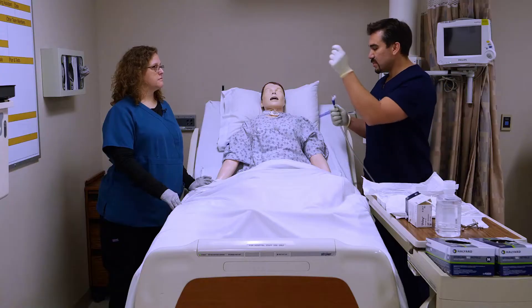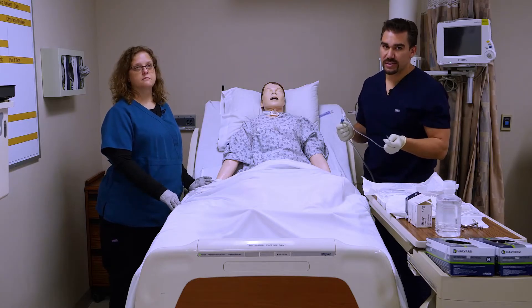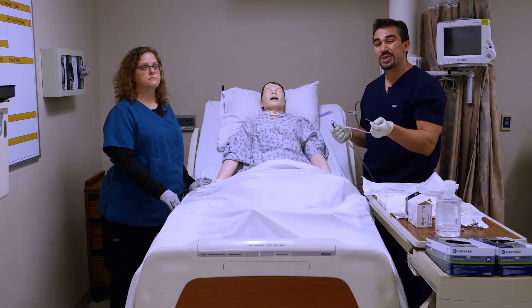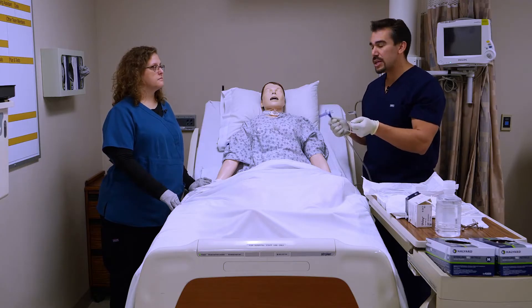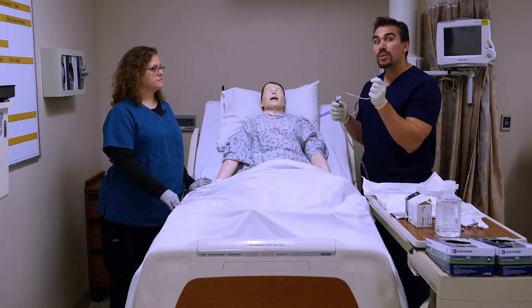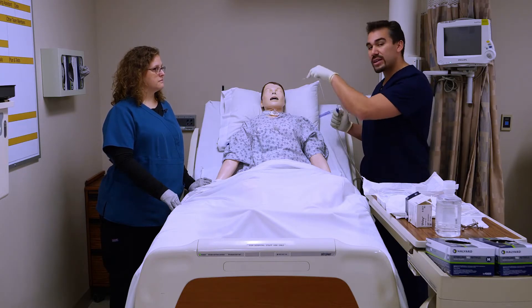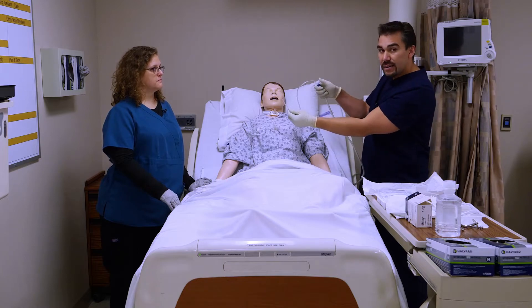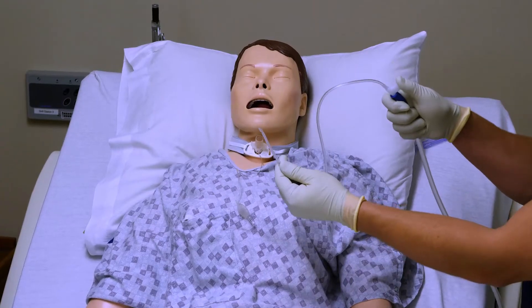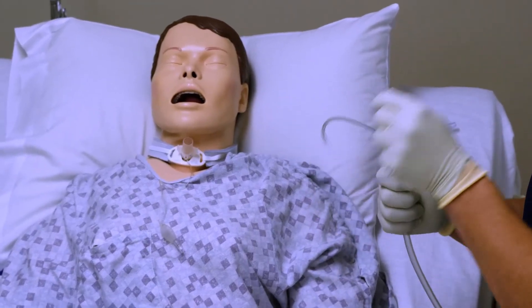The biggest thing when going in is you want to pre-oxygenate — pre-oxygenating before and after just to make sure our patient doesn't go blue. Assuming we are already pre-oxygenated, I'm going to only suction out. This is huge: we do not ever want to go in holding down the plunger or holding down the hole, because we're going to cause more trauma to that bronchi area and we do not want to do that.